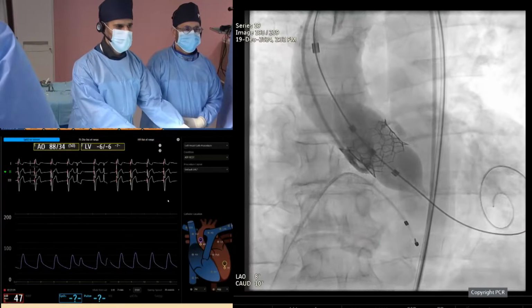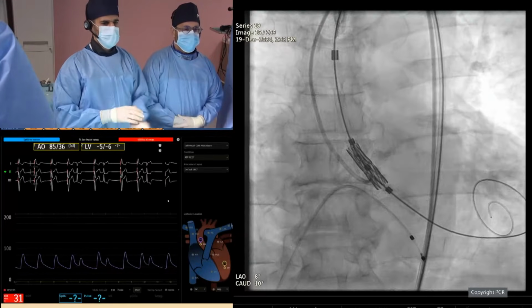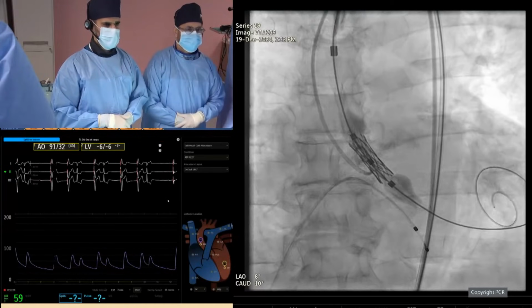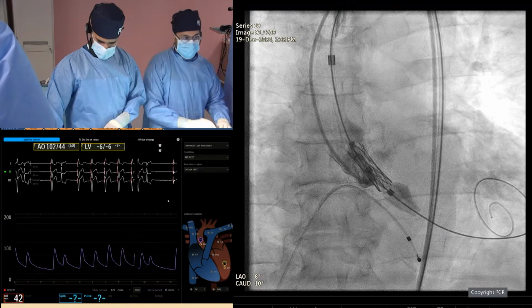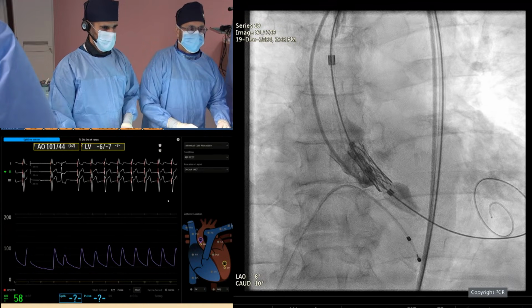Yeah, which is expected. Some advocate putting in a pacemaker before. The recipe for heart block is here. And just leave him pacing at 60. So this is despite all the precautions taken with the high implantation and the CT analysis.